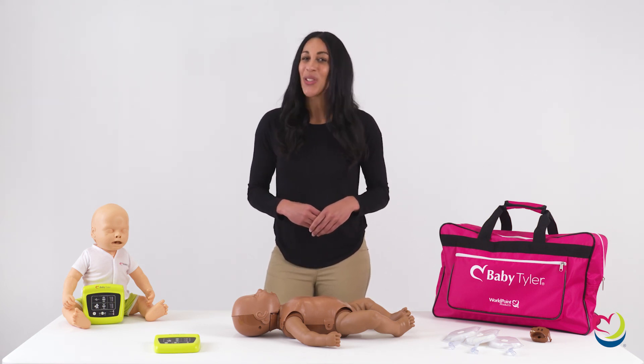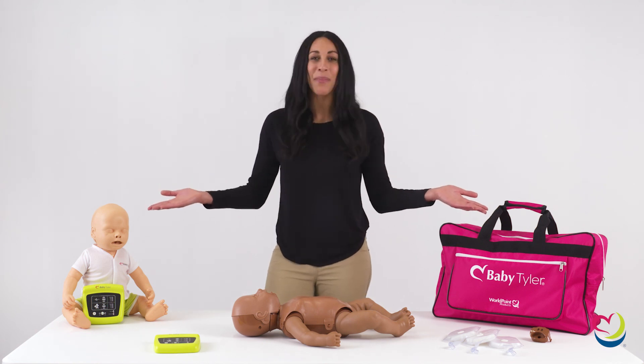Get ready to breathe new life into your CPR training with WorldPoint products, Baby Tyler.